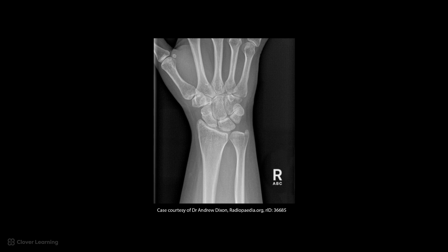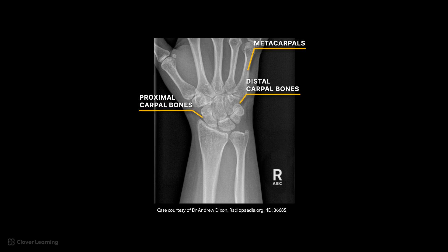Working from the most distal to the most proximal anatomy, we can clearly identify the proximal metacarpals, distal and proximal rows of carpal bones, as well as the distal radius and ulna. If we look more closely, we can identify the individual carpal bones by row.